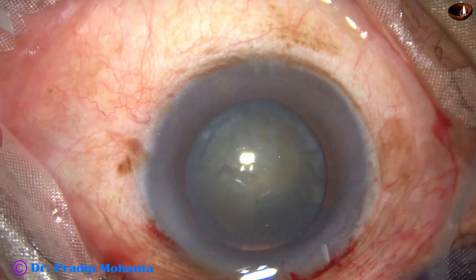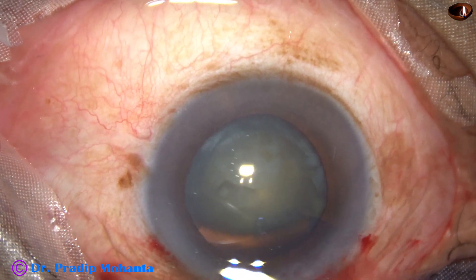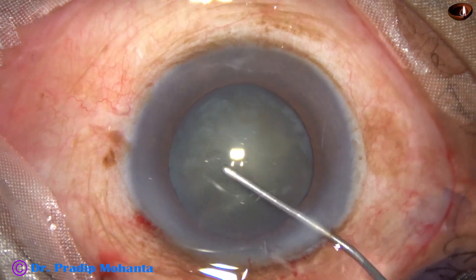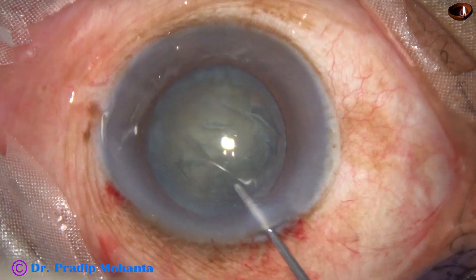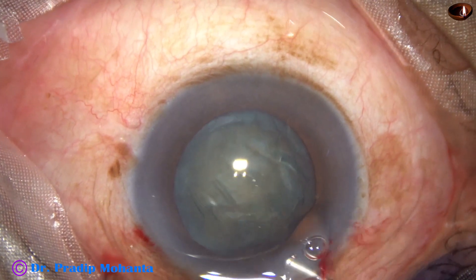The size of this rhexis is about 5.25 mm. Hydrodissection is then done with the help of BSS and a 27-gauge cannula. The nucleus is tapped and rotated. Then some more viscoelastic — 2% hydroxypropyl methylcellulose — is injected.